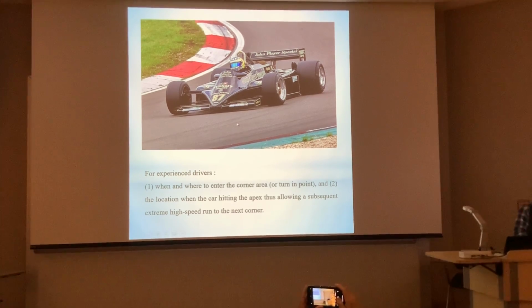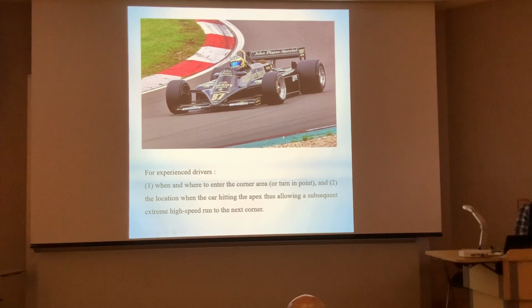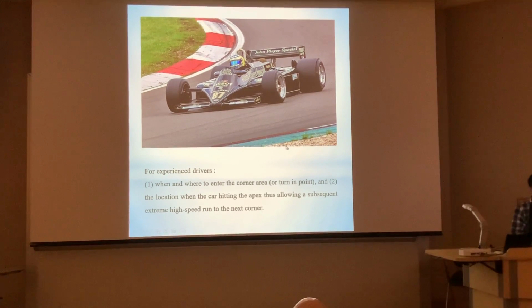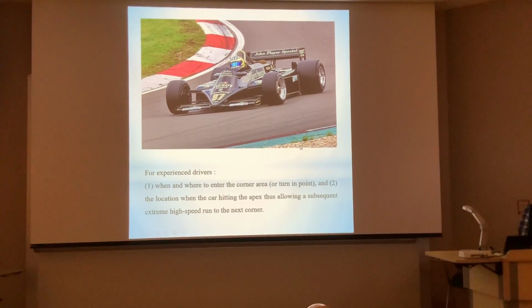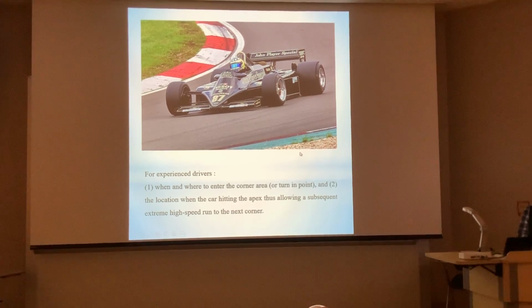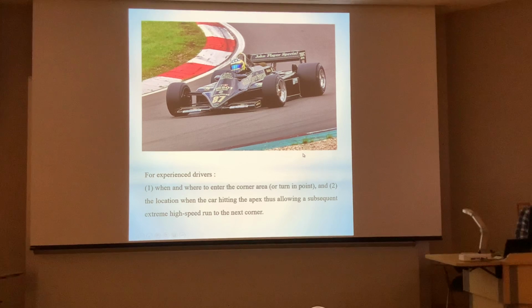And at Daytona Beach, for experienced drivers, when should the driver use the corner at the turning point and where should the cars hit the apex, and after that, you have the subsequent extreme high speed run to the next corner. This is our idea of what we observe during this angiogram, and there's similarity in these images.